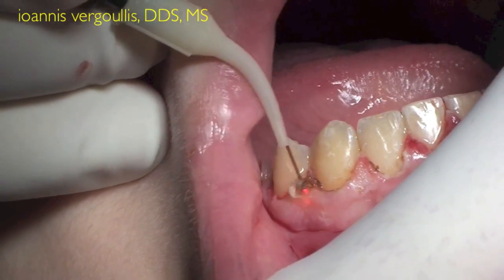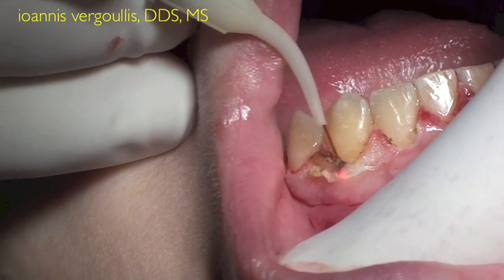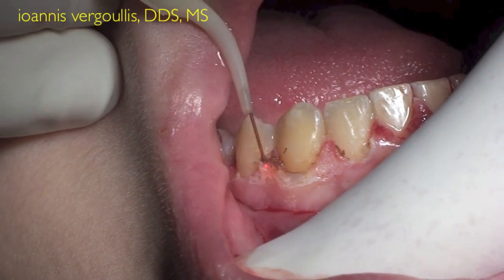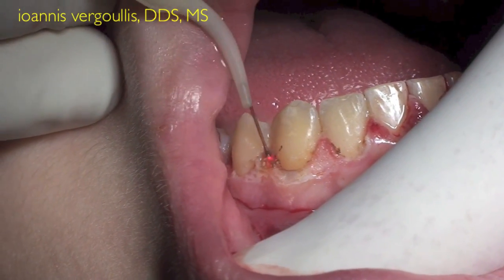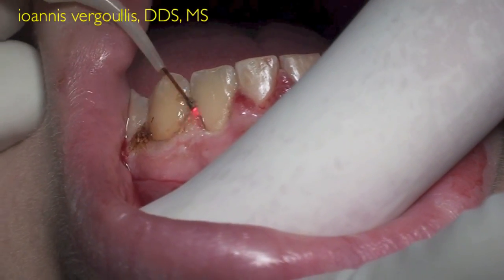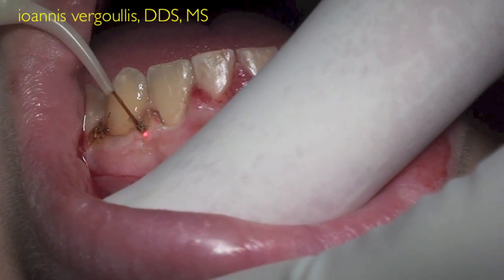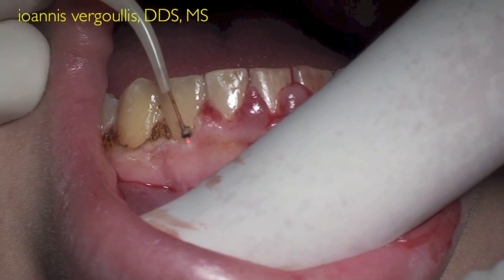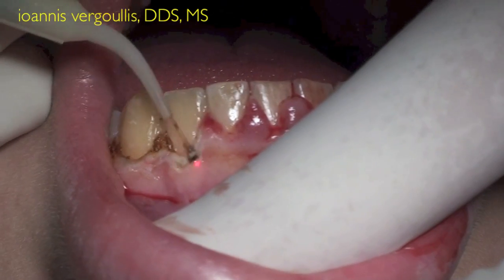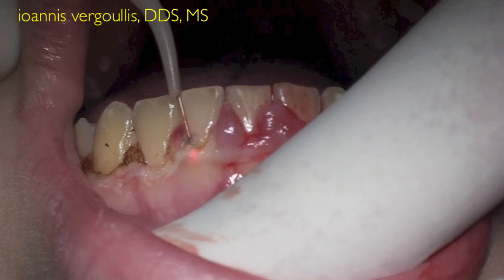And for this reason, we utilized a laser. In this case, we utilized an Nd-YAG laser with a setup of 4 watts. The laser gives us some certain advantages, such as better control, especially during the gingivoplasty, and also much less bleeding throughout the operation. Some patients also report less discomfort and faster healing process when we utilize a laser compared to utilizing a scalpel.